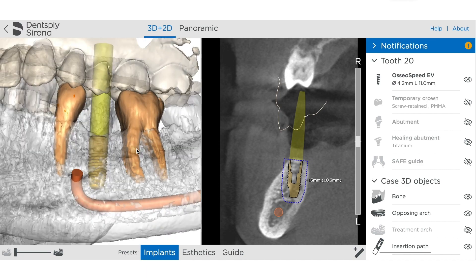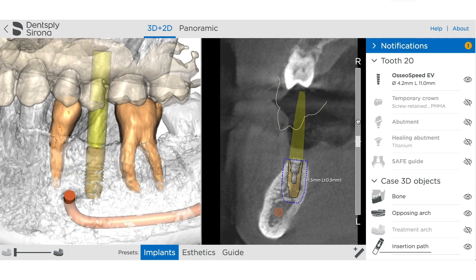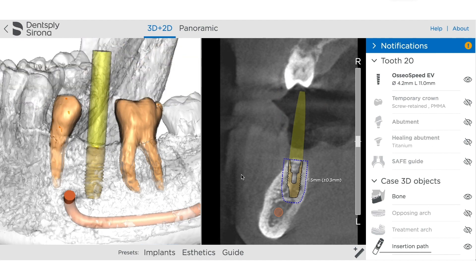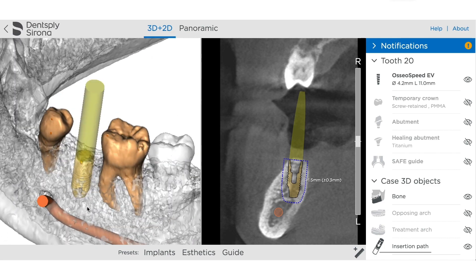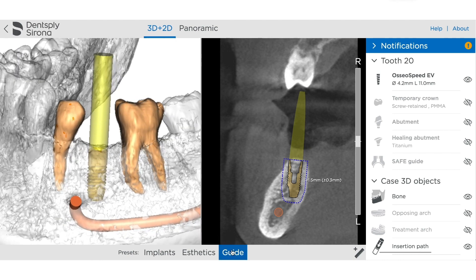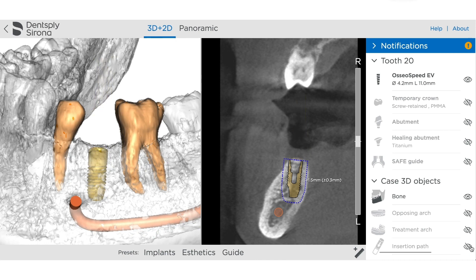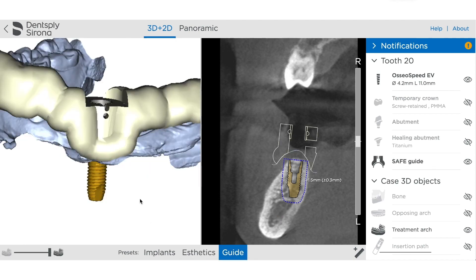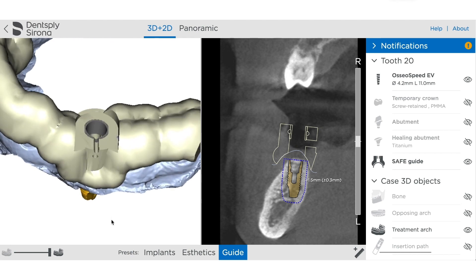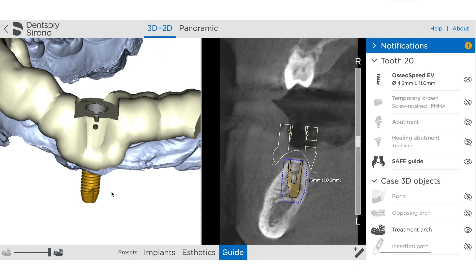Once we like the restorative components, we'll be able to look at the implant preset. Here we're going to see an indication of vital structures — teeth marked in orange and any nerves present marked as well. We want to make sure that the alignment, angulation, and where the implant sits in bone is appropriate and that you're happy with the entire plan. We also have the option to look at the restorative components to get a feel for how far subosseous or subgingival these components are going to end up being. From here we can look at the guide and see where the indexing features are, which is critical during surgery so we have access to line the case up.